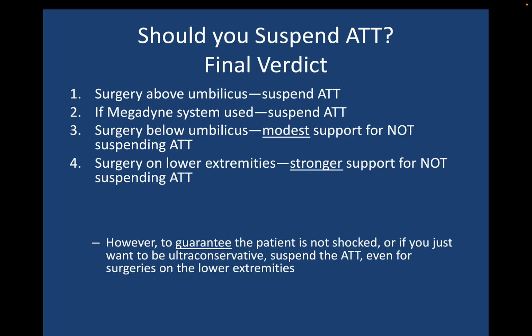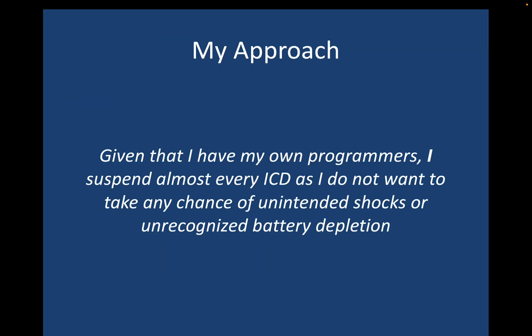However, to guarantee that the patient's not shocked, or if you just want to be ultra-conservative, suspend the anti-tachytherapy even for surgeries on the lower extremities. My practice, given that I have my own programmers, I suspend just about every ICD as I don't want to take any chance of any unintended shocks or unrecognized battery depletion.